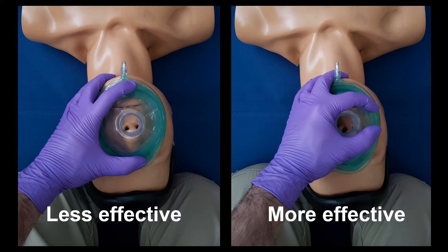Many images and videos of the EC clamp depict the C at the lower end of one edge of the mask. This does make a beautiful C, but it would be more effective to move your C higher up on the mask. This allows more uniform pressure over the mask, and for rescuers with smaller hands, it allows the thumb to be higher on the mask for a better reach for the E portion of the EC clamp.